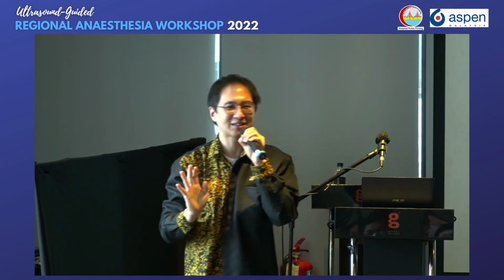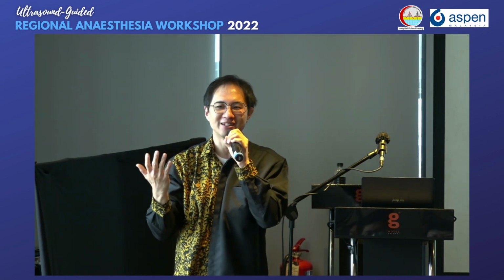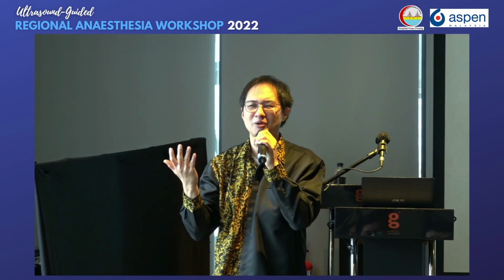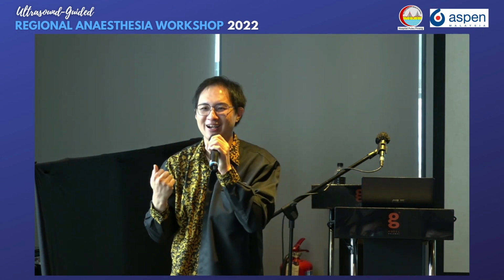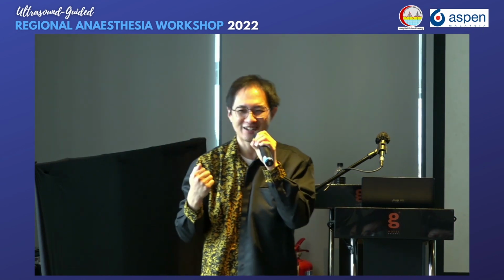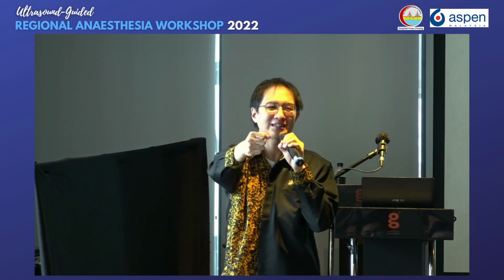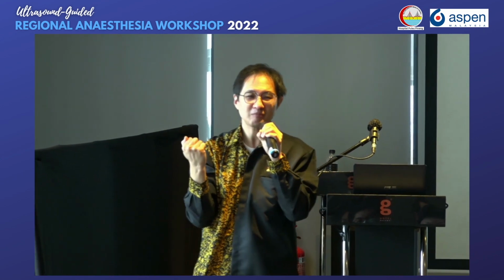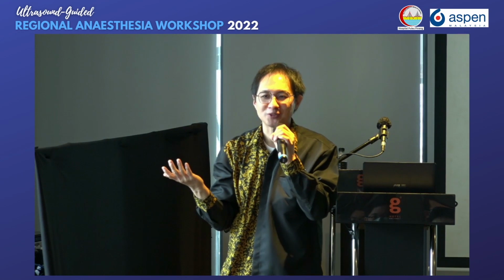If you do the classical popliteal, you find that sometimes the level of the anesthesia is just at the mid part, probably at the ankle only. Not even reaching the level where they want to cut for the BKA, sadly. So not enough. You need to slide your probe as proximal as possible. But subgluteal is sometimes very difficult also.